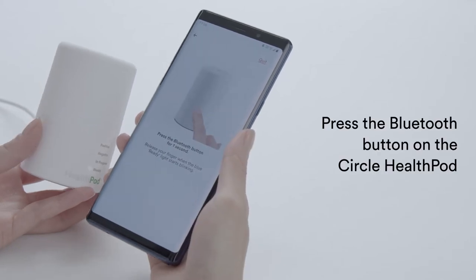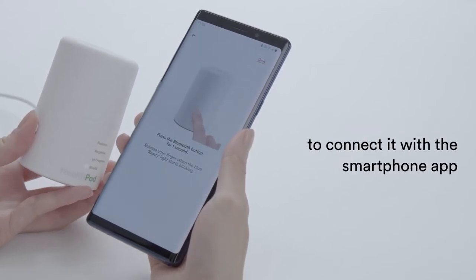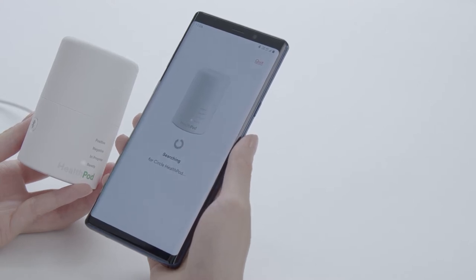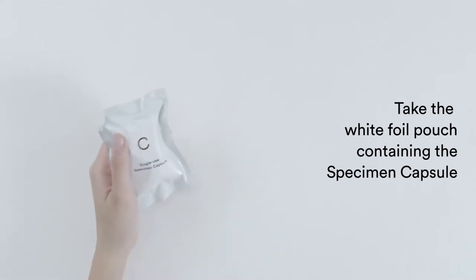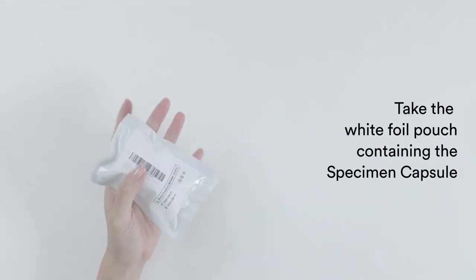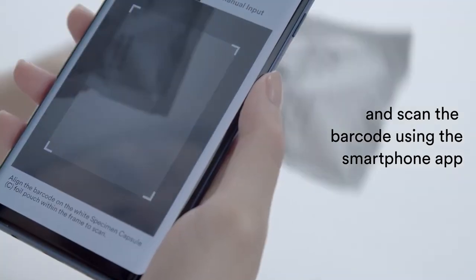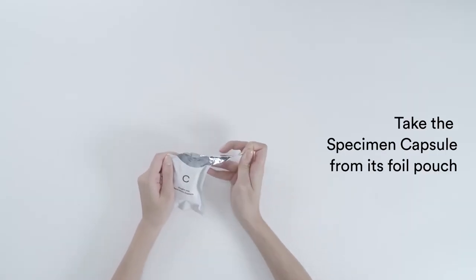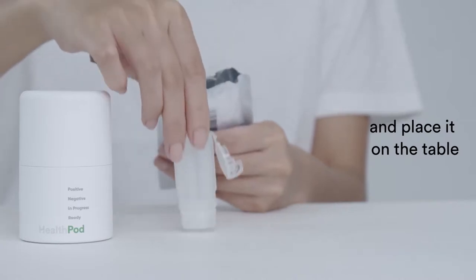Press the Bluetooth button on the Circle HealthPod to connect it with the smartphone app. Take the white foil pouch containing the specimen capsule and scan the barcode using the smartphone app. Take the specimen capsule from its foil pouch and place it on the table.